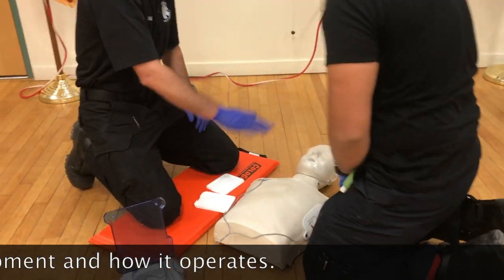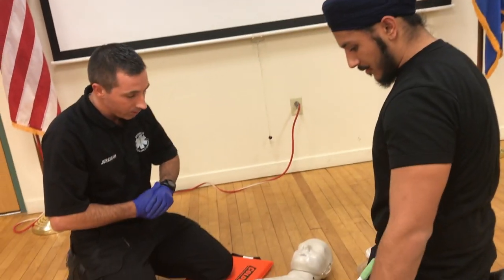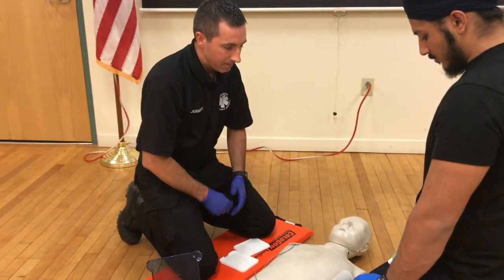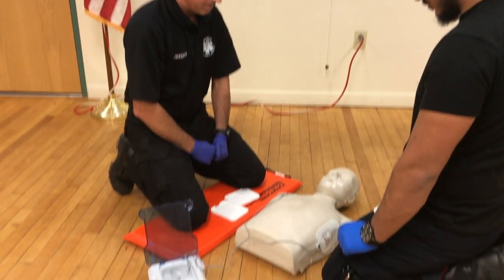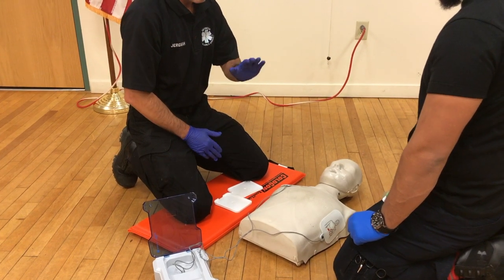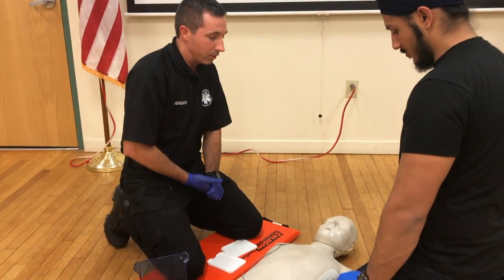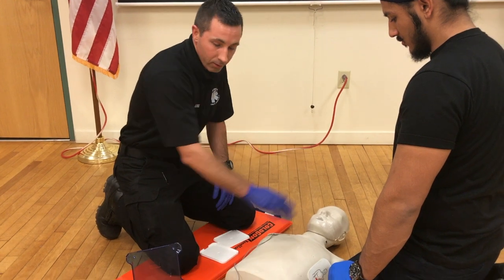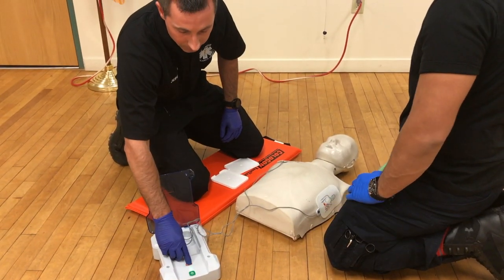Analyze — it's clear. I'm clear, you're clear, we're all clear. Press the flashing shock button. I'm clear, you're clear, we're all clear. I'm going to shock the patient.